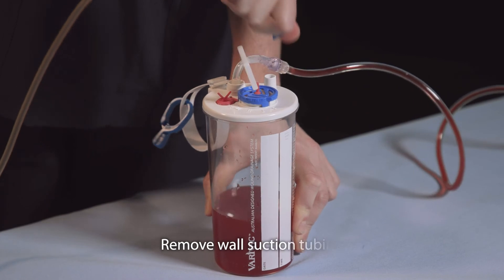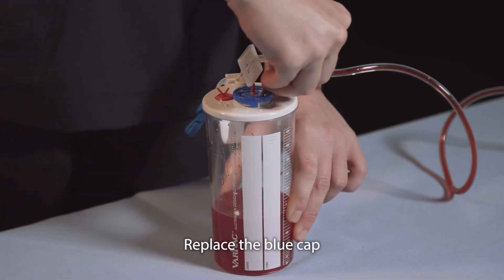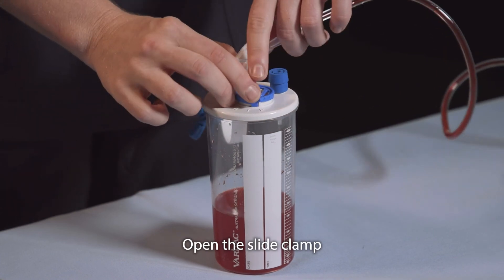Once this has happened, you may remove the wall suction tubing, replace the blue cap, and open the slide clamp on the canister to resume drainage.